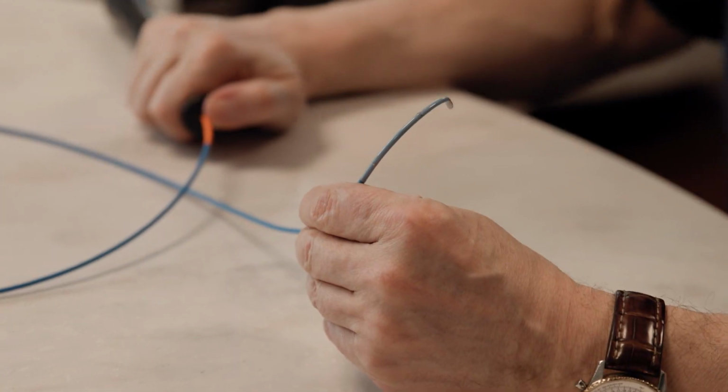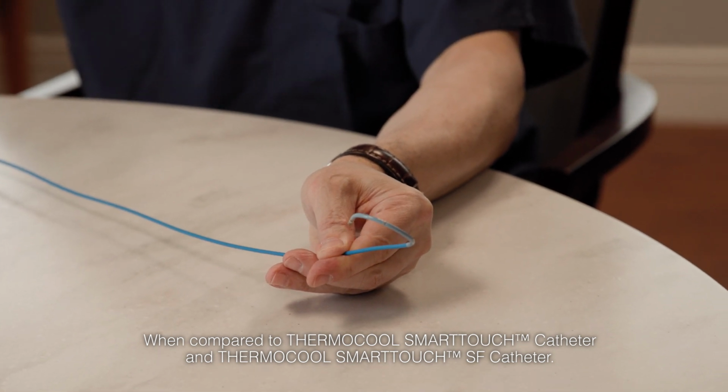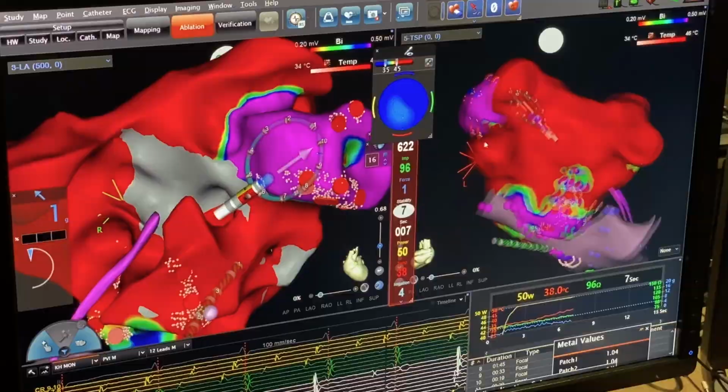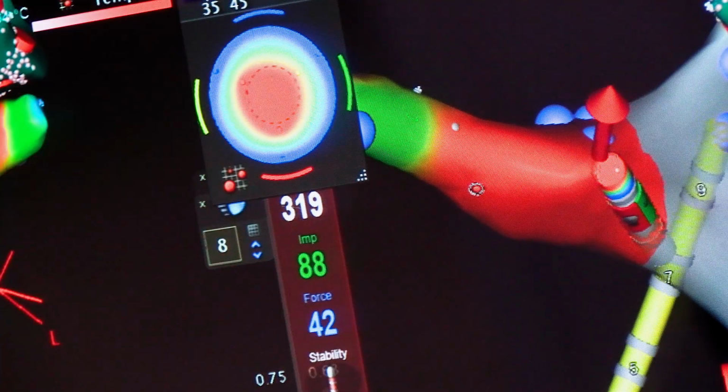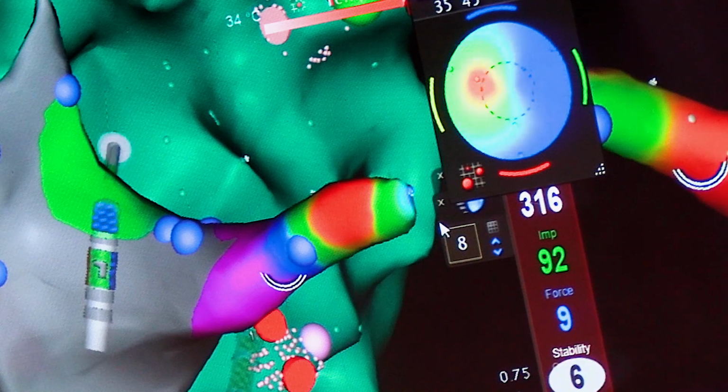The QDOT system uses microelectrodes on the tip of the catheter to better delineate scar in the mapping system to enable more pinpoint ablations. The integration of microthermocouple technology also provides a true view of the temperature during energy delivery and the angle of the catheter tissue contact. This helps reduce the chances of dangerous steam pops.